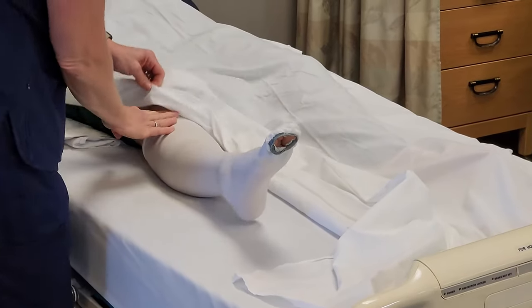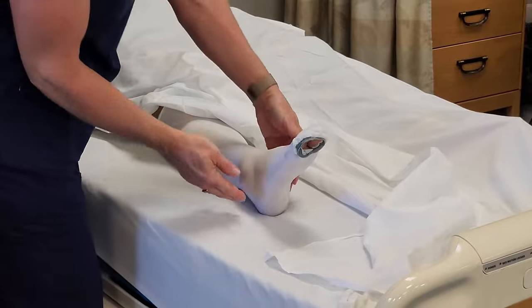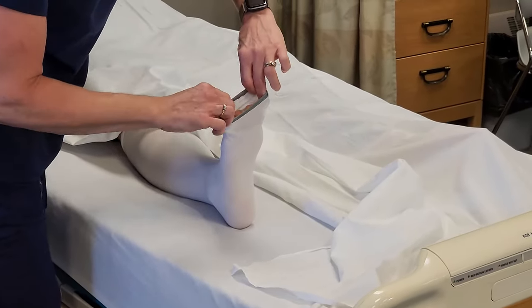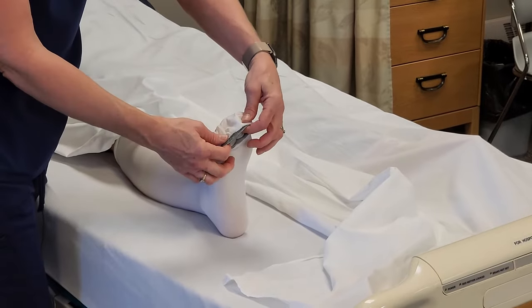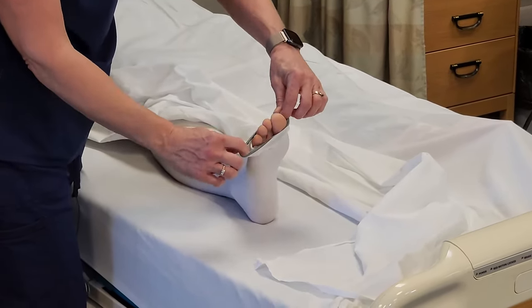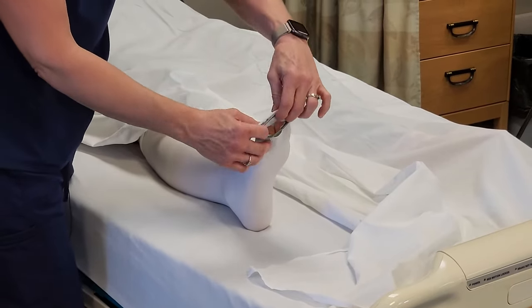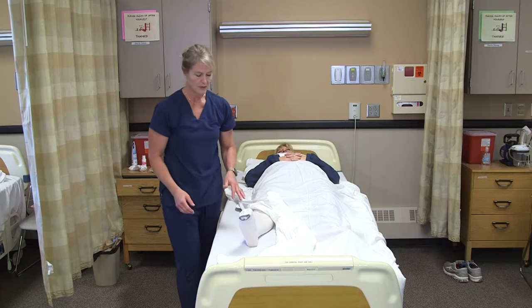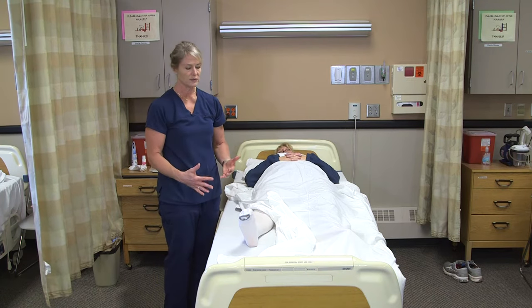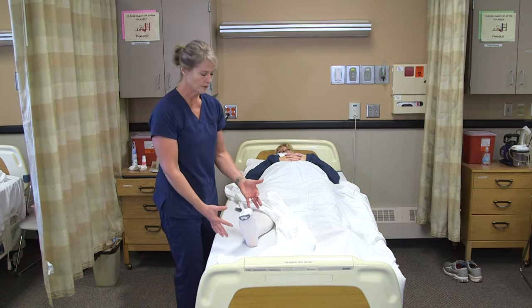These are knee-high Ted hose — there are also thigh-high Ted hose. You want to check the heel marker and make sure there are no wrinkles. This needs to go all the way over her toes or all the way behind — we just don't want that band around her toes to cause any discomfort. Typically people who wear Ted hose don't walk at all, so it shouldn't cause discomfort in their shoes. They usually just wear slippers over their Ted hose.